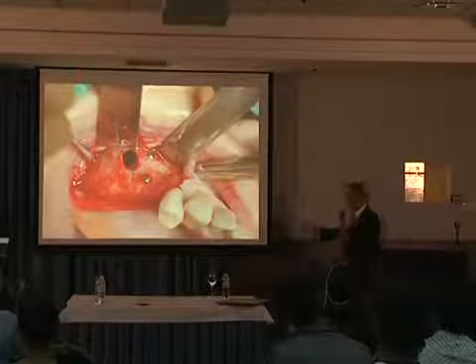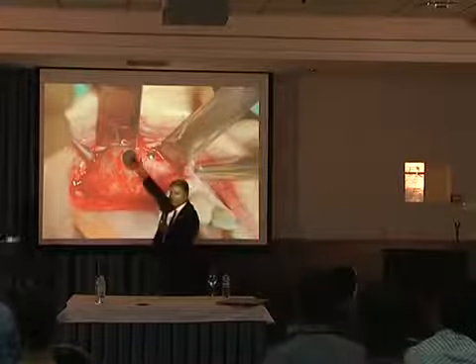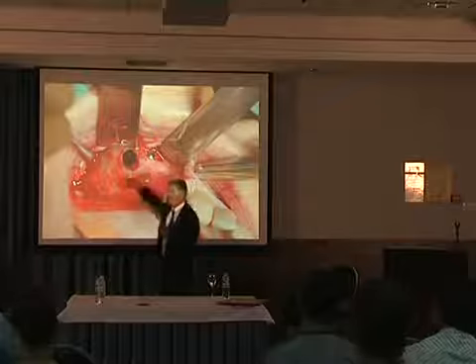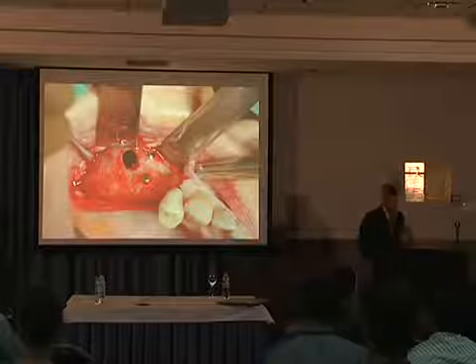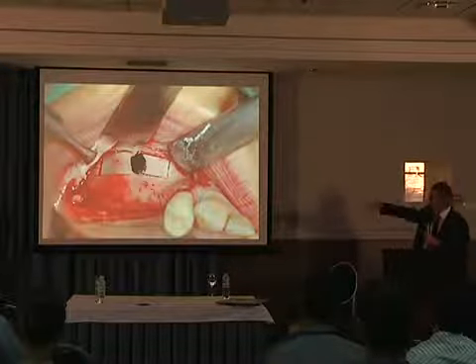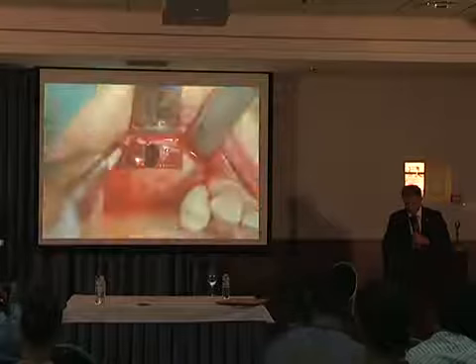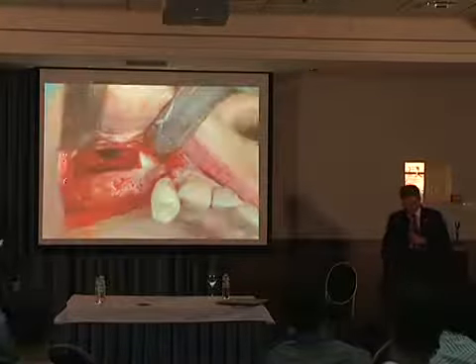So I opened a flap. Он отбросил лоскут. We find this, what we expected. Нашел вот это отверстие, которое было в латеральной стенке. Two nails from a resorbable membrane could not help. И два винта от резорбируемой мембраны, которые остались так. Anyhow, same procedure. Та же самая процедура, было сделано окно. Take out the window. Отброшено это окно, снято. Start preparation of the Schneiderian membrane. Поднятие мембраны Шнайдера.